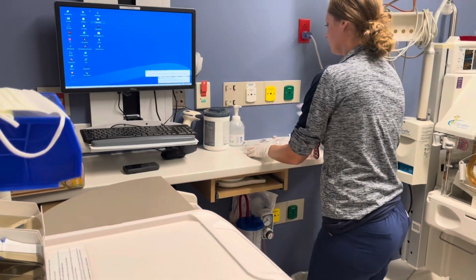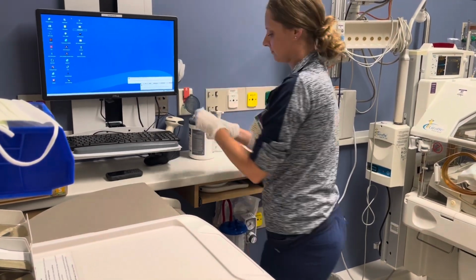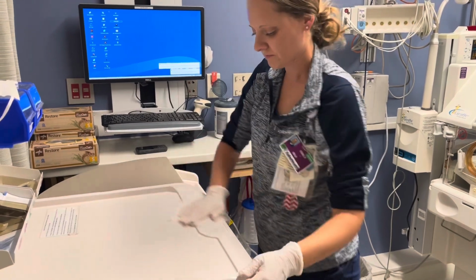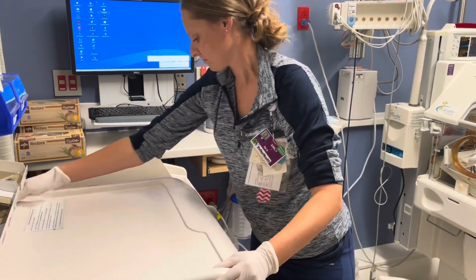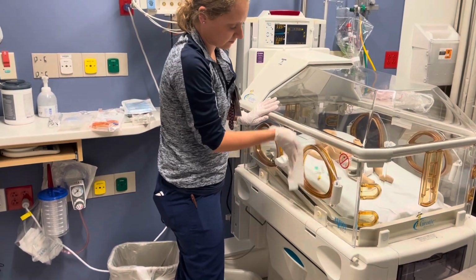Emily has gathered her supplies, verified her orders, and for TPN has also verified the weight. The supplies gathered are for a maintenance 24-hour IV change for TPN and lipids and a medication line. Emily is prepping her workspace, cleansing it with the gray top wipes. This will include all high-touch areas: countertop, bedside cart, and giraffe.